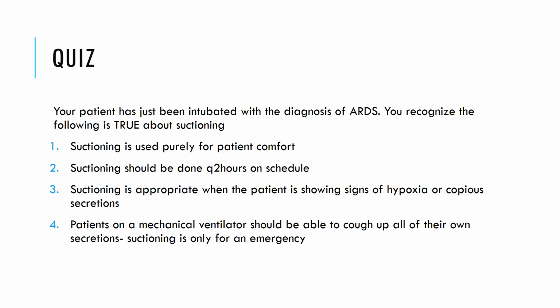The correct answer is 3. Remember, this is actually very uncomfortable when we suction our patients, and we don't want to routinely suction without assessing whether that patient needs suctioning. And also, while suctioning may likely occur during an emergency, it is also for when a patient is just coughing but not able to clear their airway.